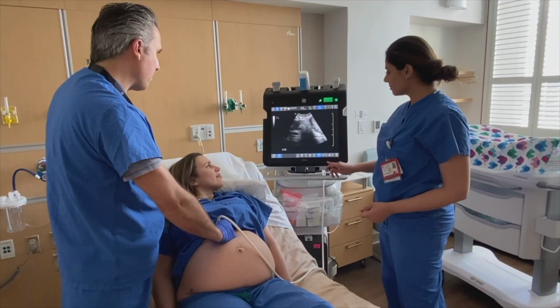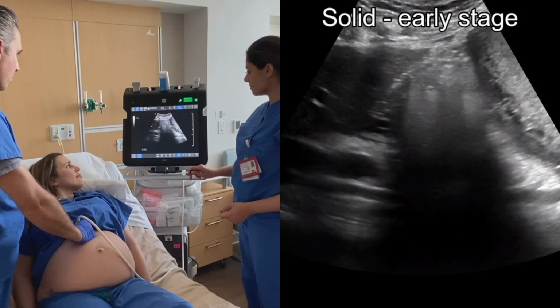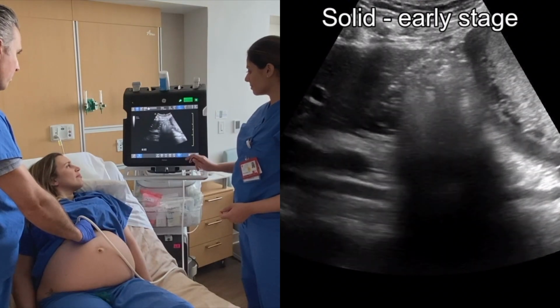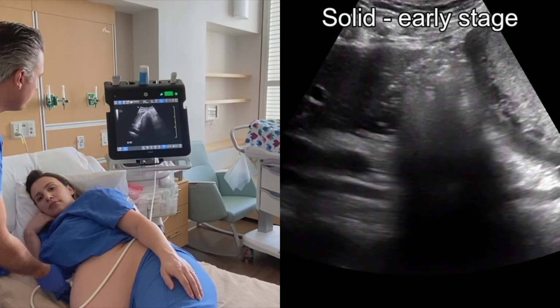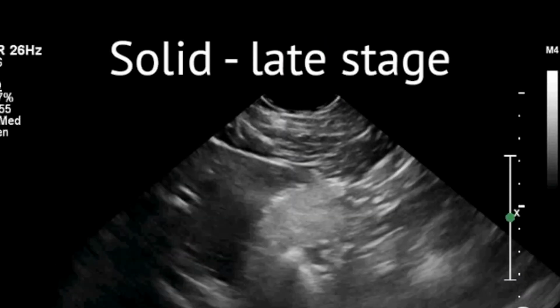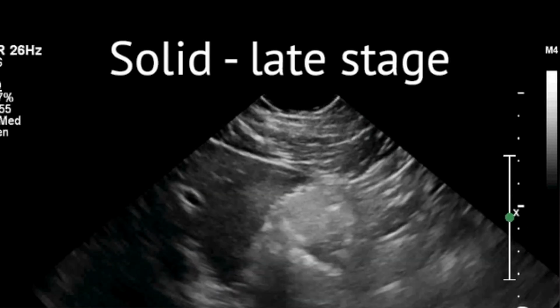We are now visualizing the antrum shortly after a solid meal. In the early stage, the antrum appears distended with mixed echogenicity described as a frosted glass pattern due to a mix of air and solids. In the later stage, 1 to 2 hours after a solid meal, the antrum contents appear more homogeneous and hyperechoic.